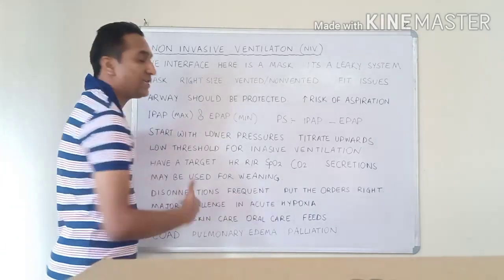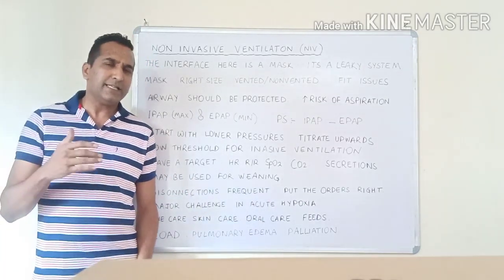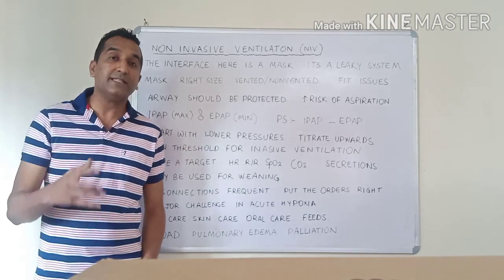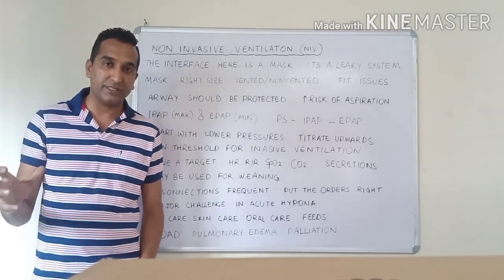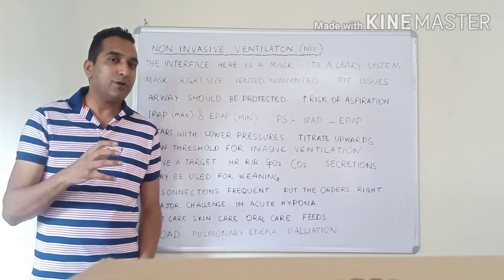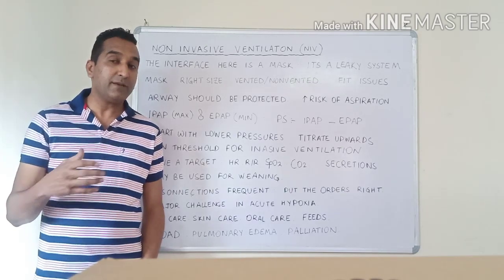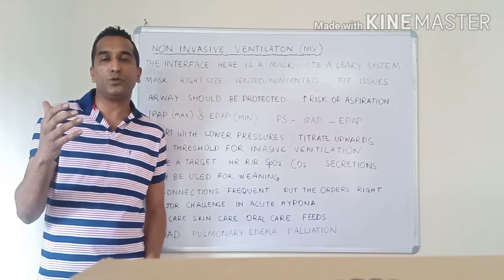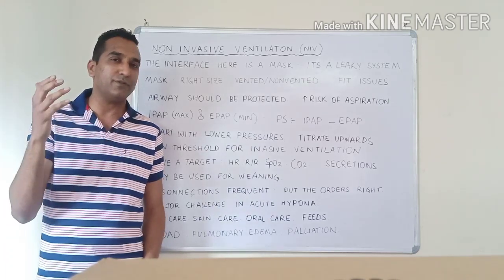And this is a major challenge in acute hypoxia. It is increasingly being used in mild to moderate ARDS, but ARDS is an acute hypoxemic condition. You apply an NIV, you probably would not be able to disconnect it for long, and that becomes a very uncomfortable experience for the patient. You cannot use non-invasive ventilation non-stop for 3, 4, 5 days.